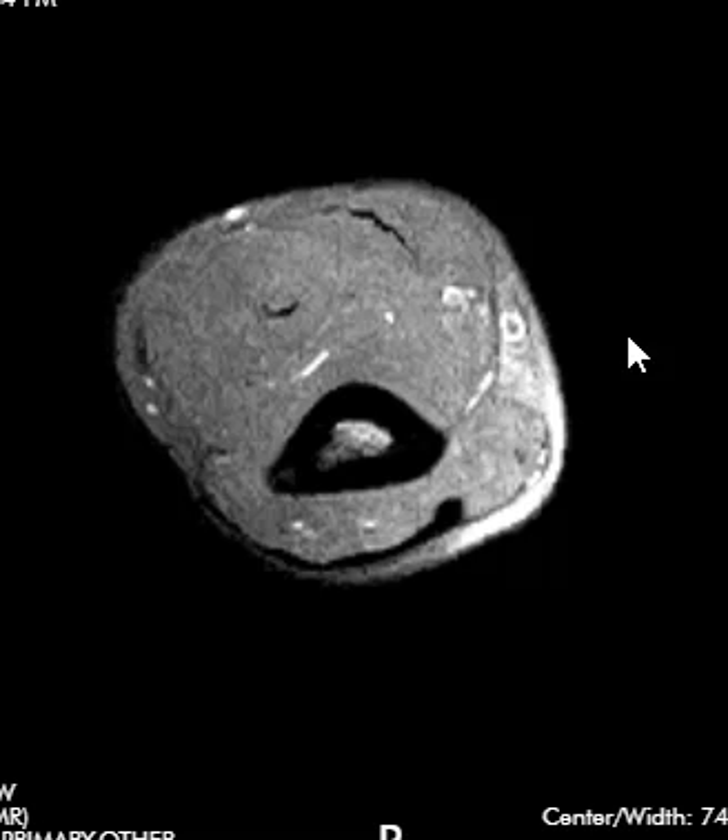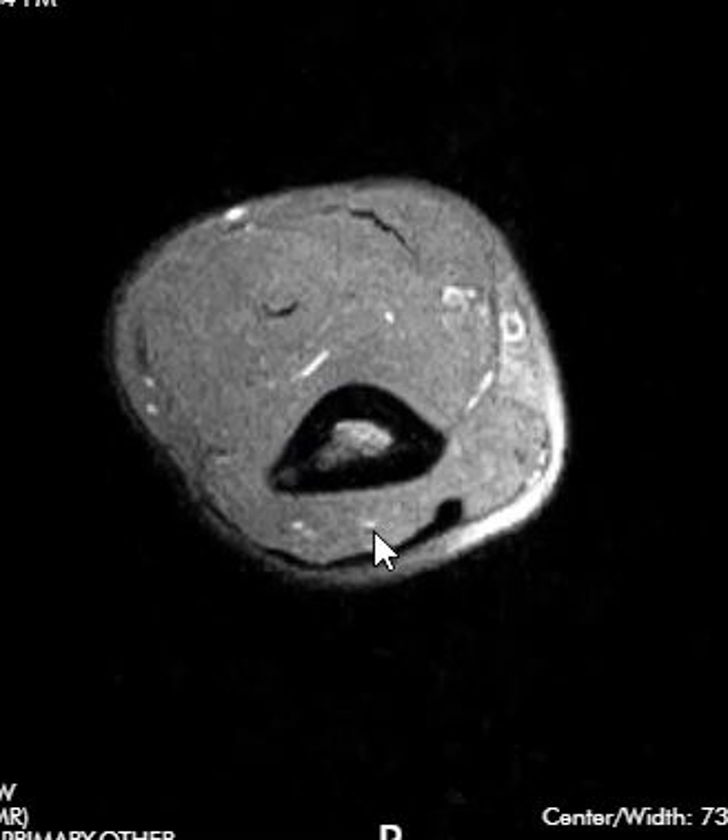I'll start with this sequence — this is called an axial sequence, where we're slicing from the top down. This is the distal arm; this bone is the humerus. To get oriented: the very back here is the triceps area, this broad tendon is part of the triceps tendon, and the very front here we see the very bottom of the biceps muscle with a small dark band — this is the central tendon of the biceps.